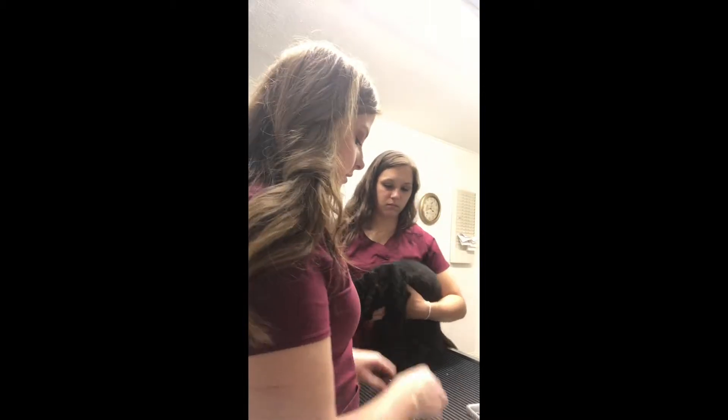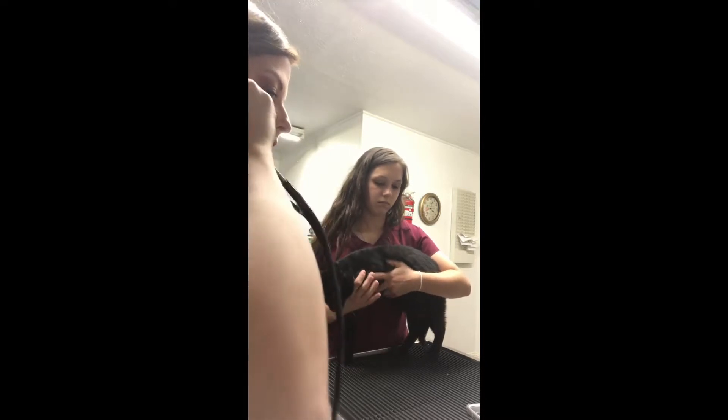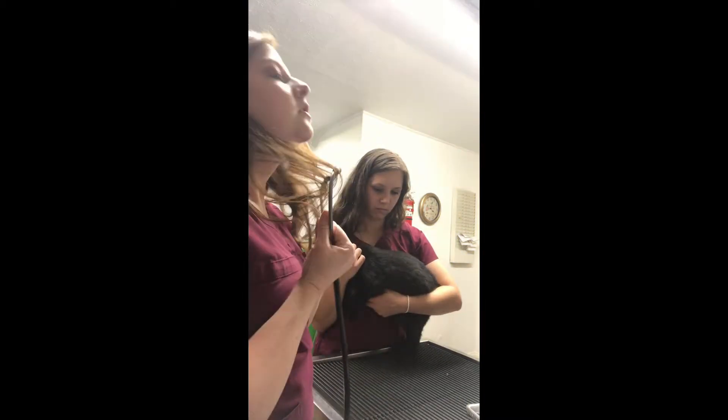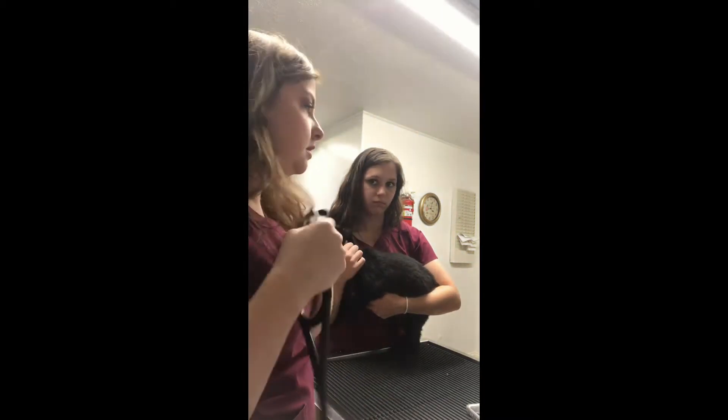Now I'm going to use my stethoscope to listen to the different valves of the heart. We have the pulmonic, the mitral, and the aortic, and then over on the other side we have the tricuspid. I'm just going to listen to her and check all the different valves.